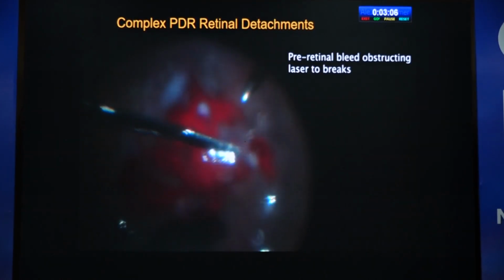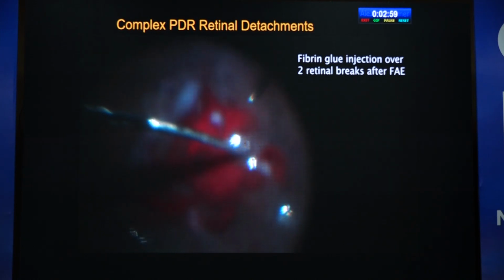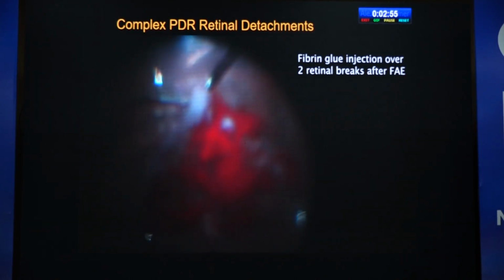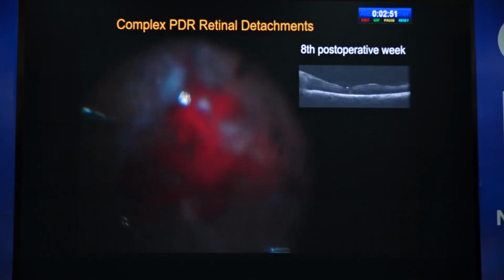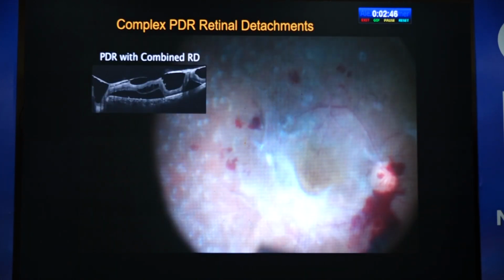Similarly, a second case, again bleeding during surgery, which is not allowing laser for the breaks. So the two components of the glue, fibrinogen and thrombin, are injected sequentially, one after the other. Preferably the more viscous one should be injected first, but either can be injected first with good results.